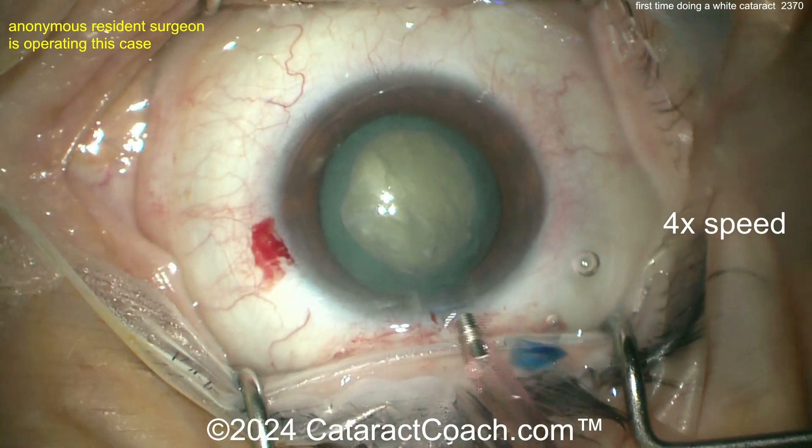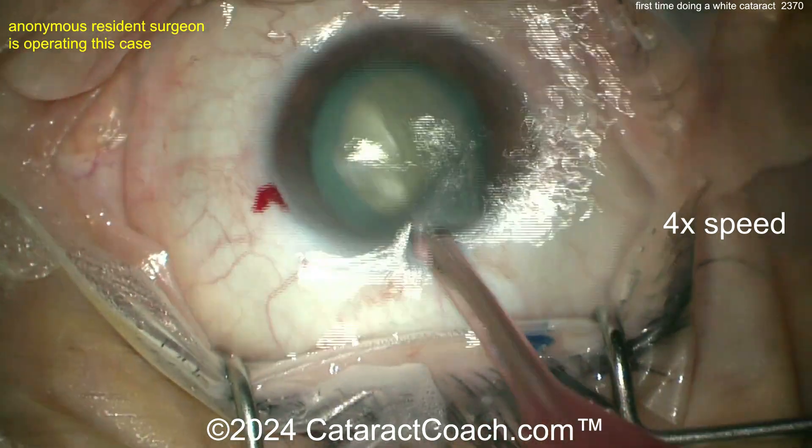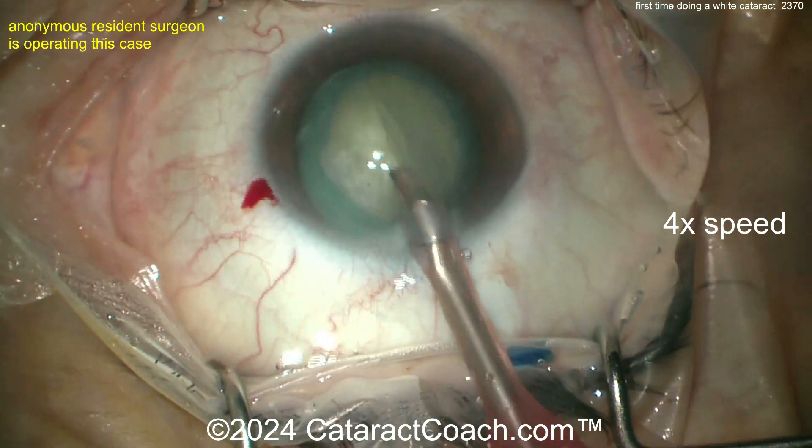Now hydrodissection — be cautious because you can't see the fluid wave, so I wouldn't go straight across; I'd go to the side, go left or right. Sometimes with white cataracts you don't even have to hydrodissect, because if there's liquefied lens cortex it's already pre-dissected. Now going on with the phaco probe.